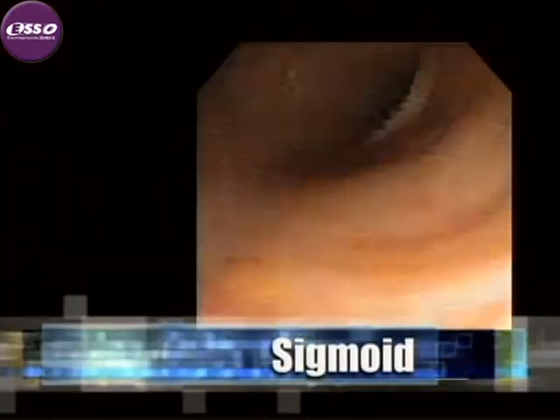When we are outside of these regions, lesions that are sent for surgical resection, particularly laparoscopic resection, or lesions that must be identified on follow-up endoscopic examination, should be tattooed with carbon black. General clues to location include the following. The sigmoid tends to be tubular, narrow relative to the more proximal colon, to have multiple angulations on insertion, in particular compared to the descending colon, which tends to be straight, and in some patients, extensive diverticular disease is a clue to the sigmoid.